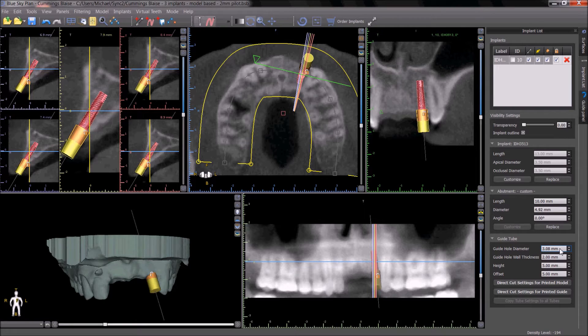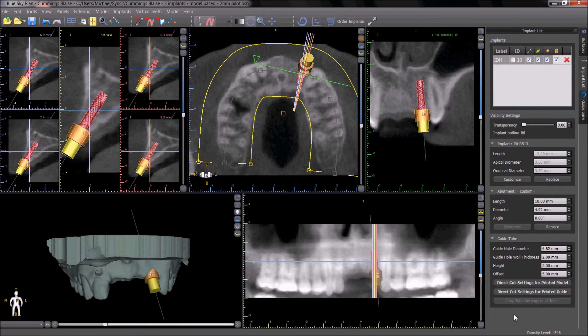In this situation, the guide hole diameter should be set to 4.82. These changes should be made to all the implants and guide holes in the case.